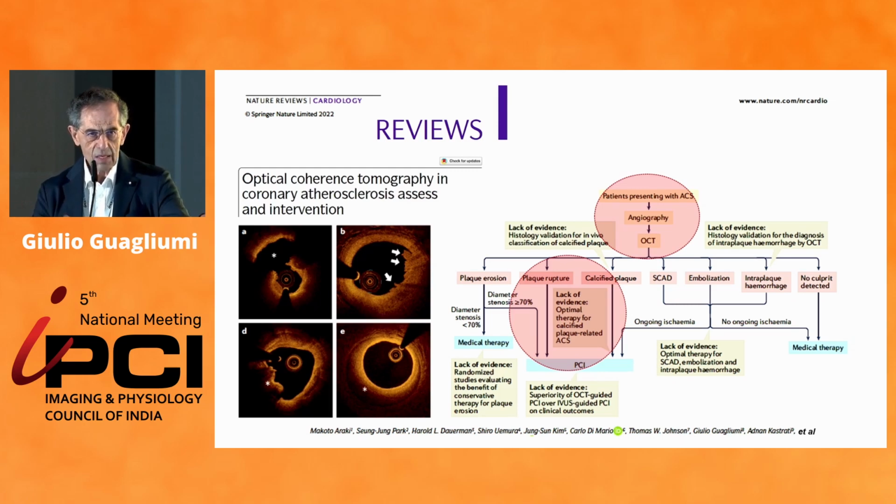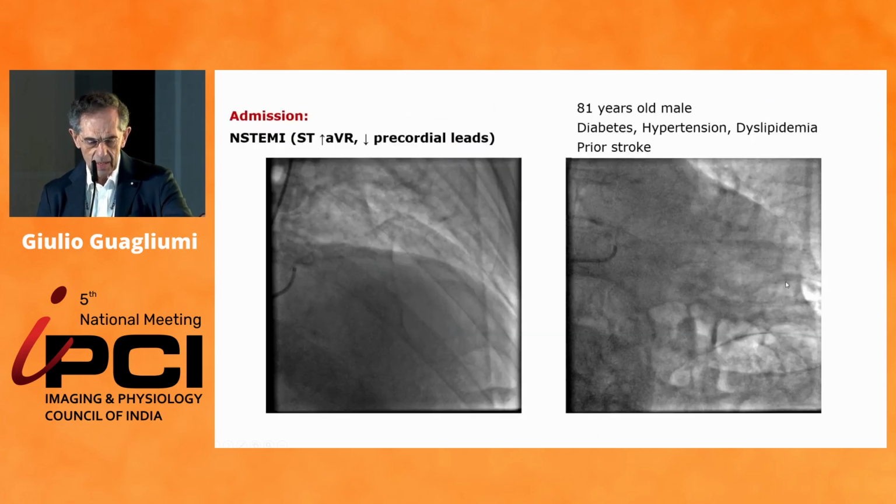This is one of the last papers released by multiple authors, and you can see how much is the lack of the evidence that we still have when we have a patient presenting with a calcification and acute coronary syndrome. So there is a huge amount to do that OCT can help us in depicting.